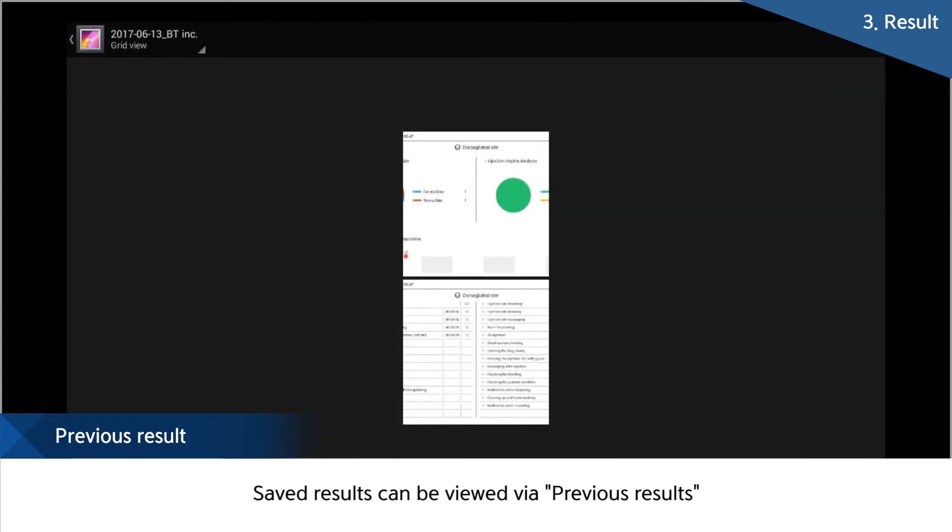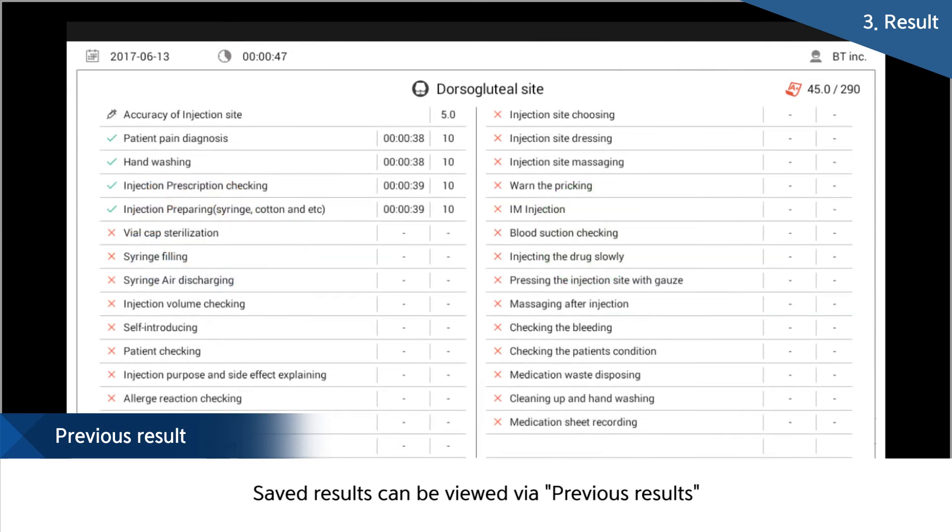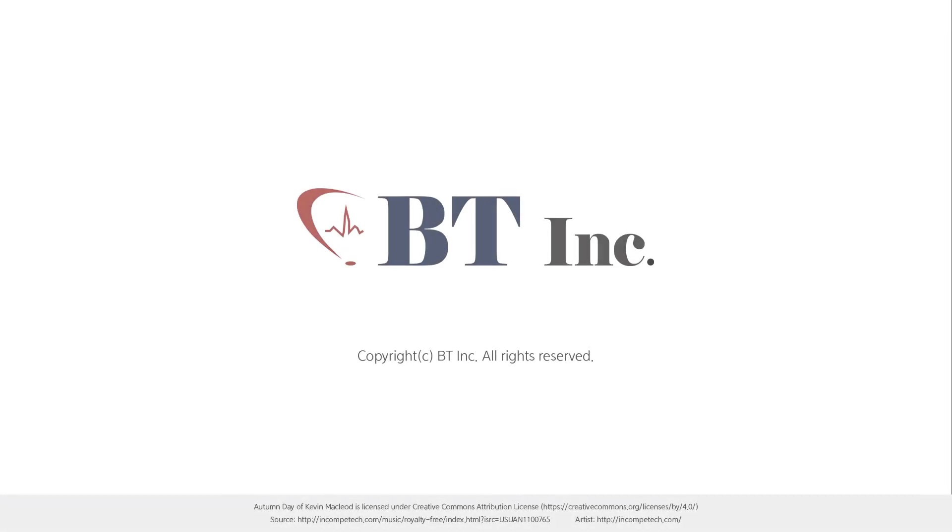BT aims at increasing the quality of education with our unique feedback and self-practice system, which enables trainees to check all the details and results in real time. BT provides products with the best quality for next-generation education with our own technology.